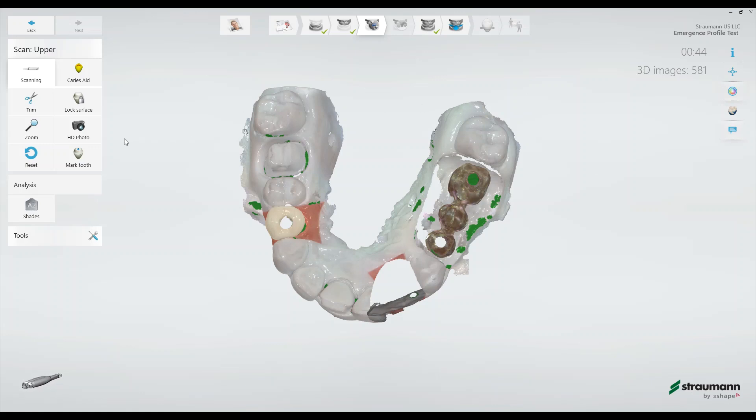One additional tool we have in our toolkit is to select the zoom icon over here, which actually changes the focal depth of the camera.